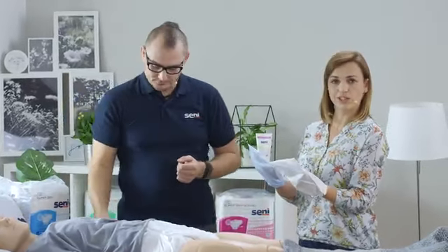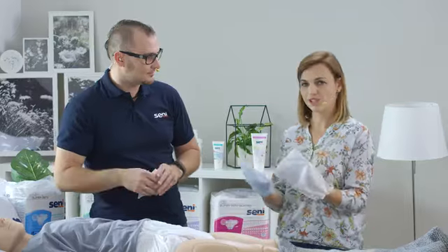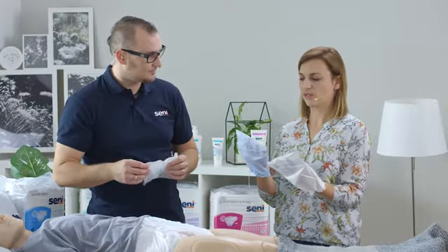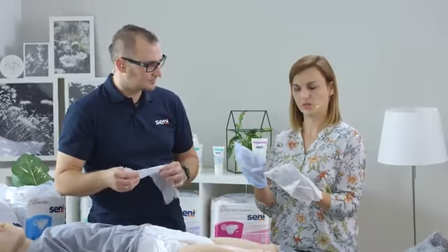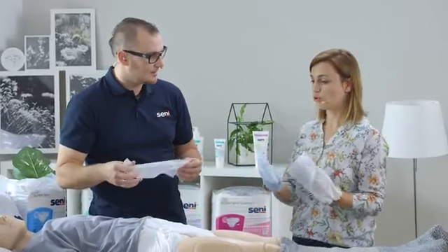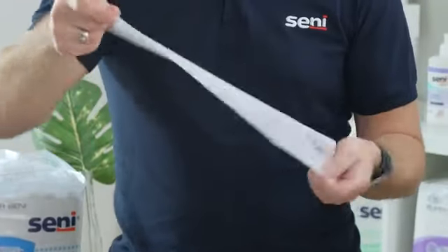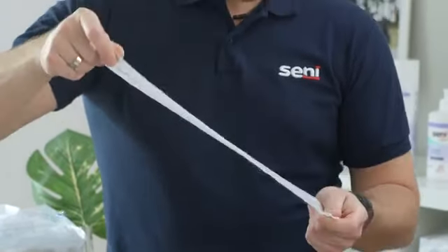Sure, keeping in mind that the patient stays in such a product 24 hours a day, 7 days a week, maintaining proper thermal regulation and proper skin care is particularly important. What else is important in such products? I would like you to focus on what I'm holding in my hand.